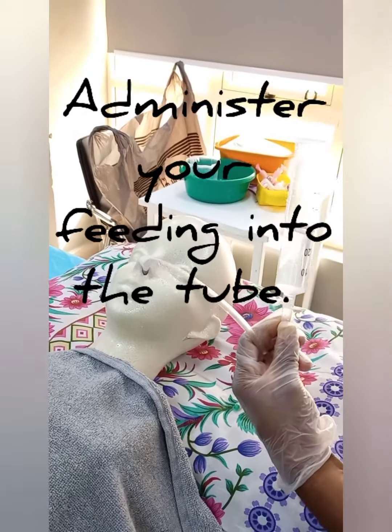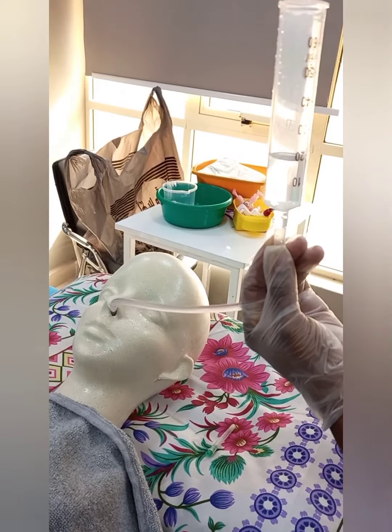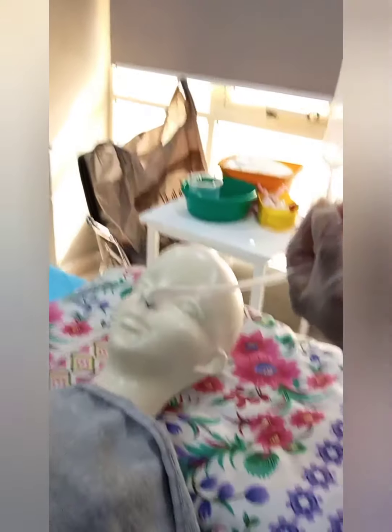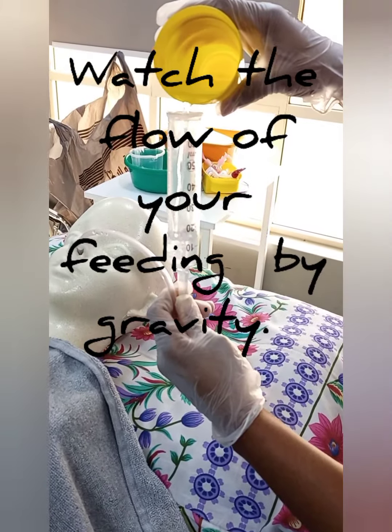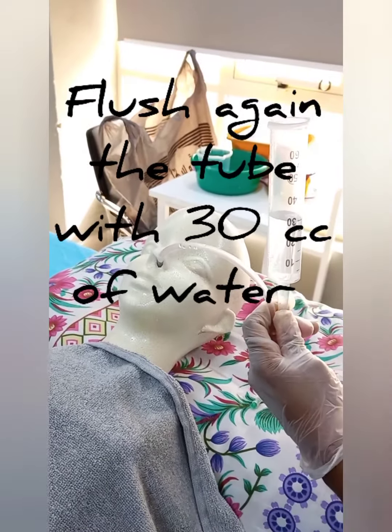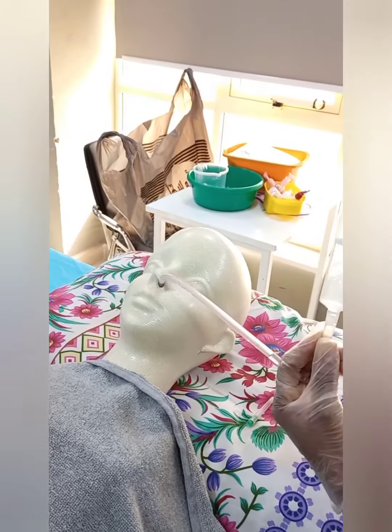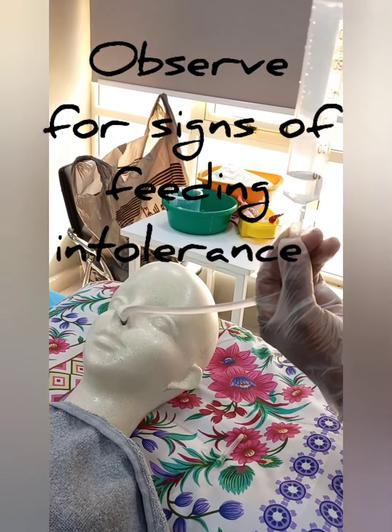Administer your feeding into the tube. Raise your syringe just above your patient. Watch the flow of your feeding by gravity. Flush again the tube with 30 cc of water. Observe for any signs of feeding intolerance.